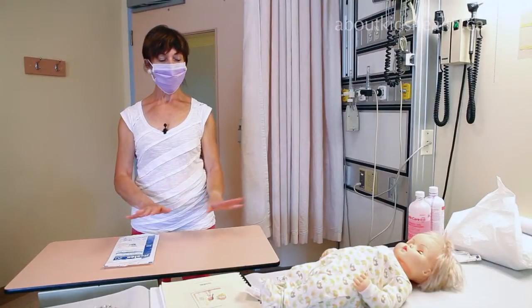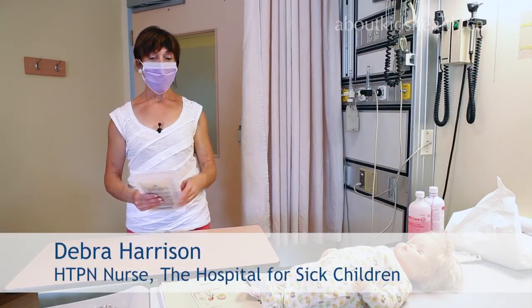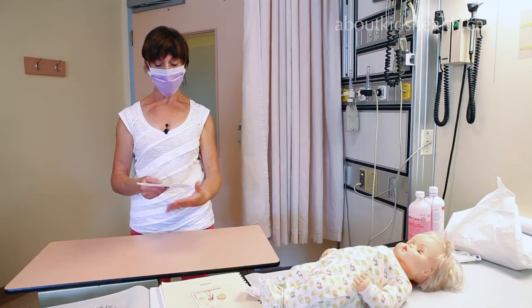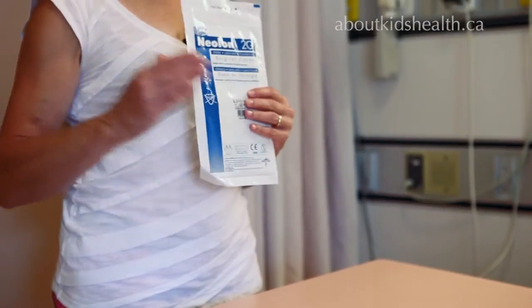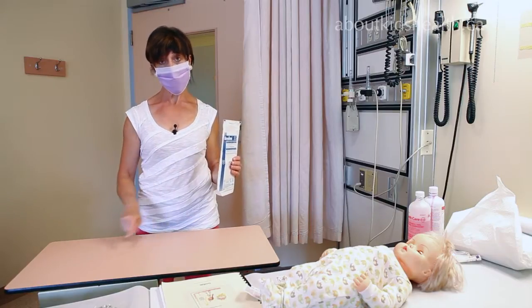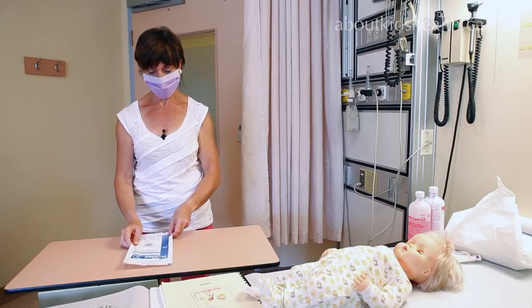Now that you've seen how to deal with sterile technique and you've set up your sterile tray for a particular procedure — either the cap change or the dressing change — the next thing you need to do is put on your sterile gloves. Your hands have been washed, your mask is on, your tray is set up, and we've already cleaned the table with alcohol so the surface is ready for your sterile gloves.